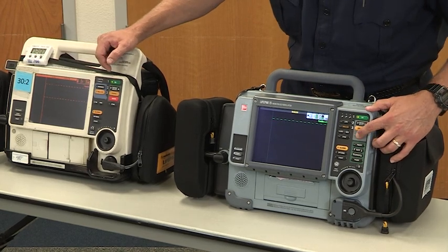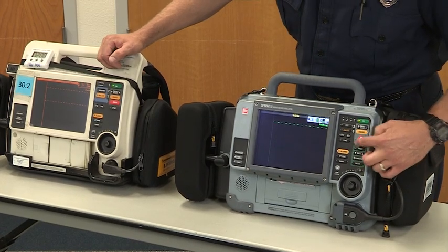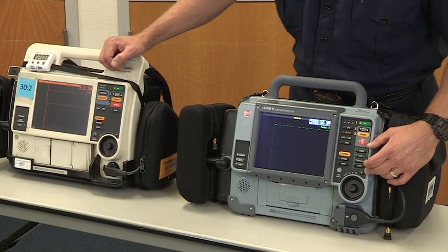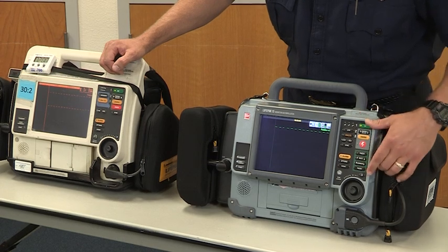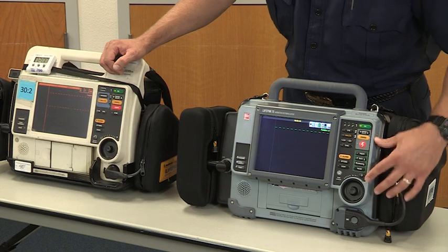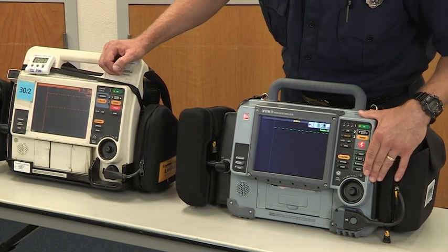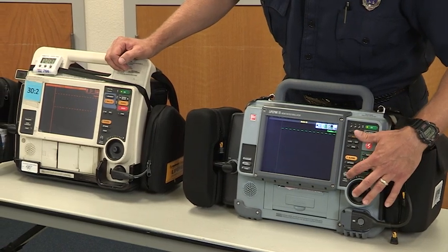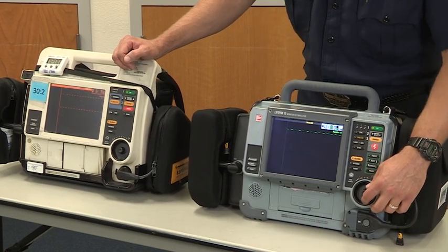Although we can clearly see this is a round button versus an oval button, I don't think we'll have any confusion there. You'll see that there's a pacer feature on the LIFEPAK 15 that's been disabled. This comes as an option that we can't get rid of on the LIFEPAK 15, so just disregard that. Below that, there's a button for day and night screen. It will change the screen from black to white, or you can change it back to black from white. All the other buttons you'll see are the same. The alarm, options, event, and home button are located in the same location, along with a speed dial selector button.